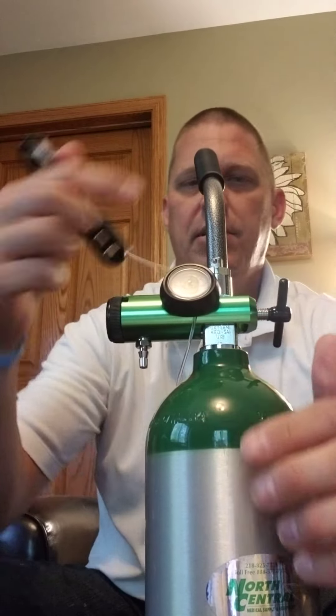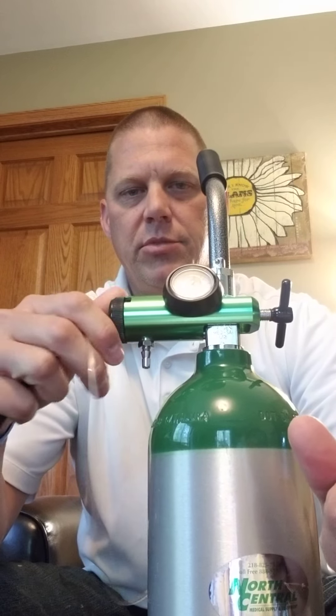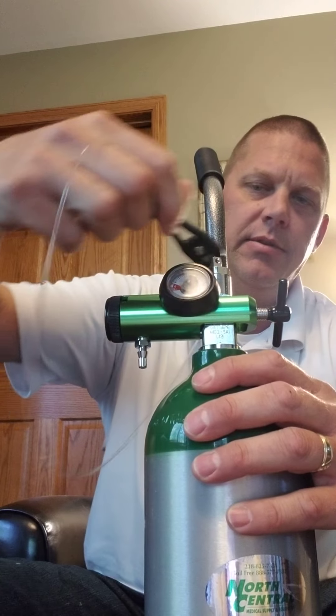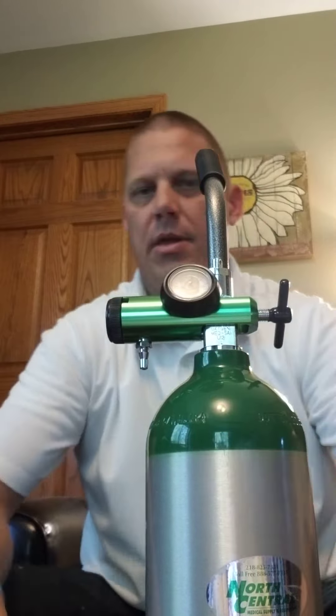Hello everybody, I'm Chad Hansen with North Central Medical Supply and Equipment. Today I'm going to give you a quick demonstration on how to put a standard regulator onto an oxygen tank. The one I have here is an oxygen E-tank, and I do have it already in a cart with two wheels on the bottom so it rolls around and you can pull it wherever you go.